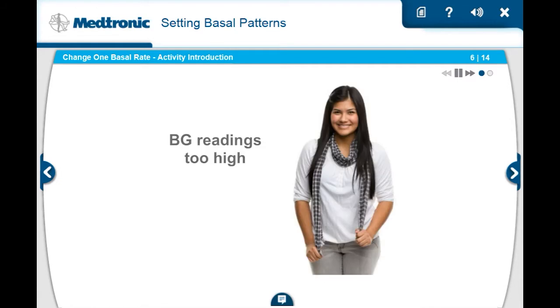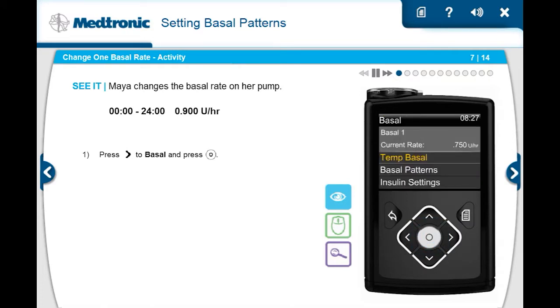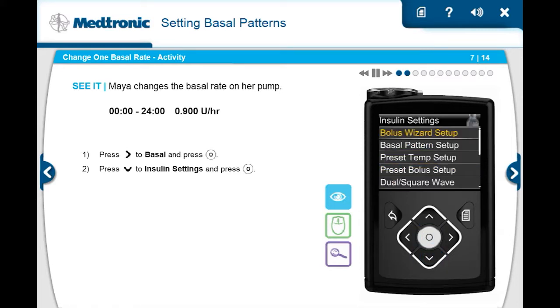Maya's blood glucose or BG readings are a bit higher than she would like. Her doctor advises her to increase her basal rate to 0.900 units per hour. From the home screen, she presses right to basal and then presses select. She presses down to insulin settings and presses select. Maya presses down to basal pattern setup and then presses select.